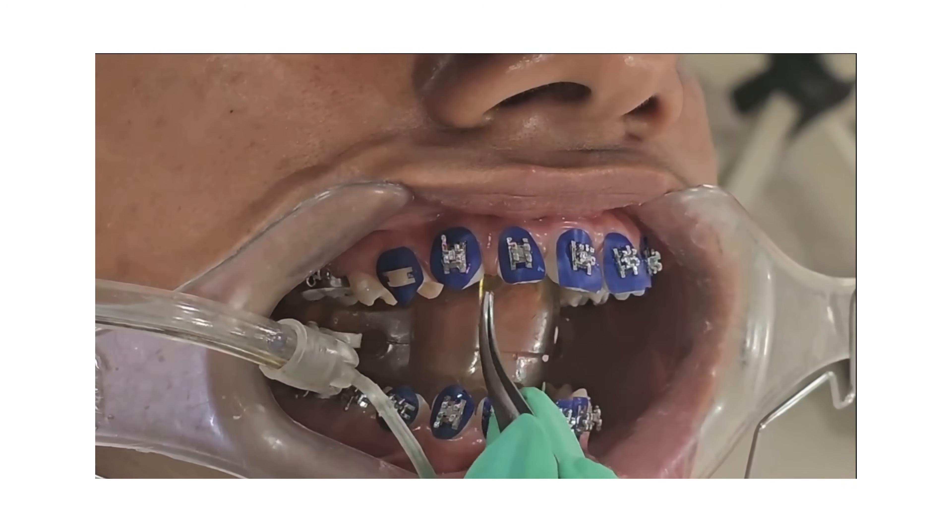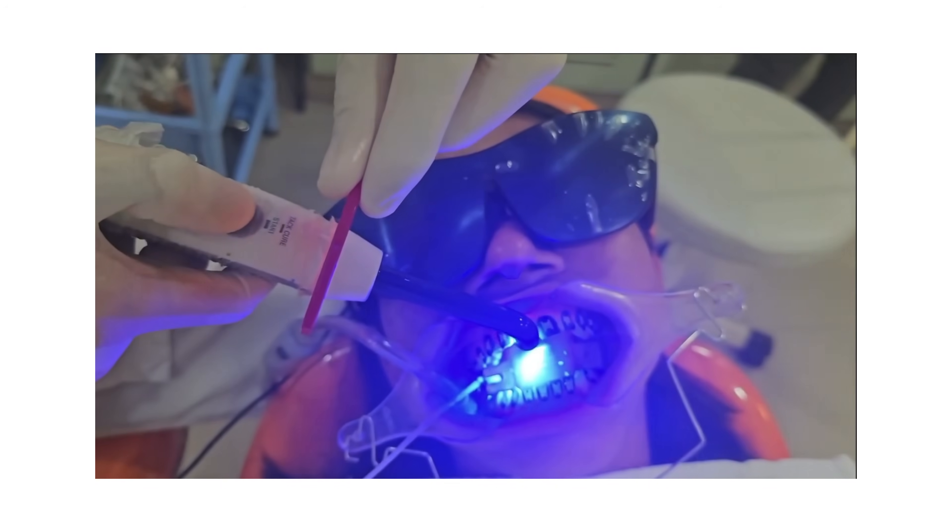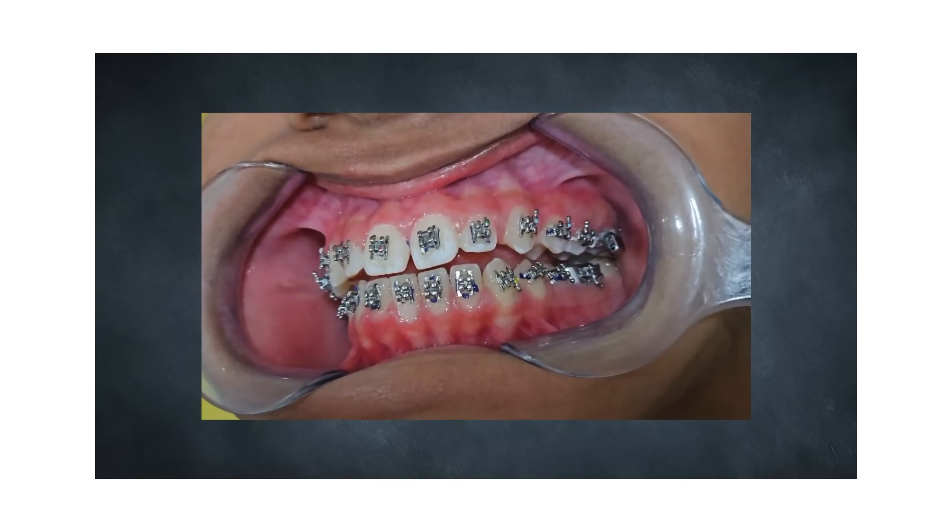Apply primer and bond the bracket. Light cure and gently unpeel the stencil. Voilà — it is done.